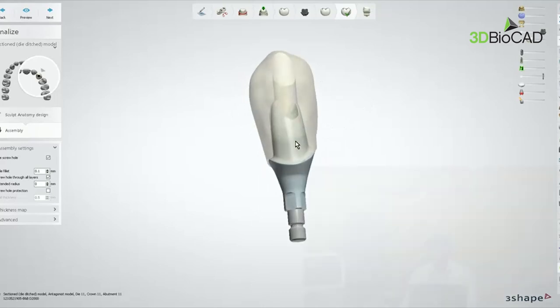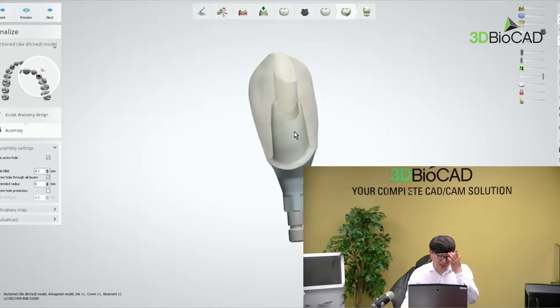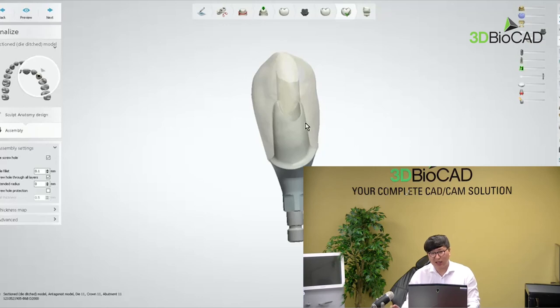Okay. So we just saw how to use abutment design plus crown. And next time we're going to go through the screw-retained crown if you need a bridge. And then after that, the third video is going to be how we do the model build with the implant case. Simply, we can just merge each other and get into the model build. After printout, we have to put the analog in. We know that part, but I have another option.